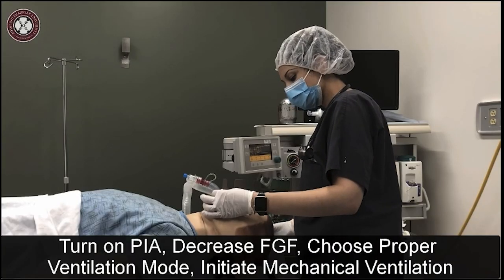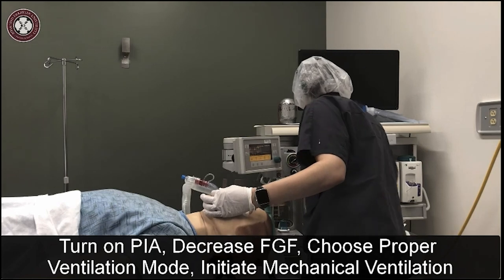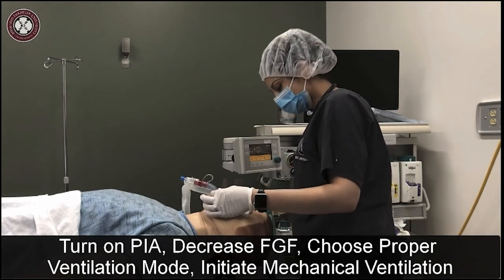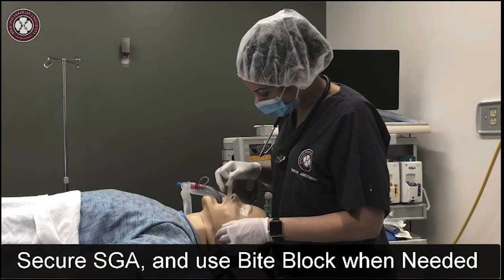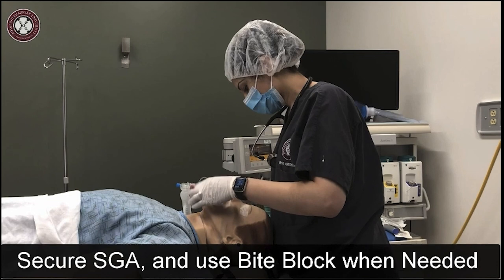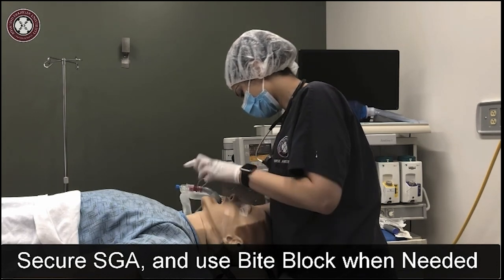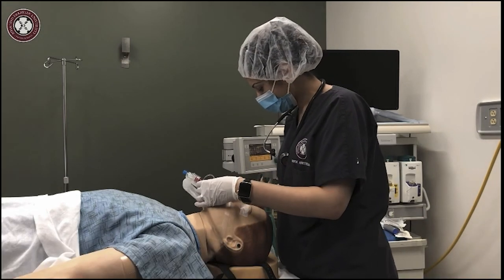With successful SGA placement, turn on the chosen potent inhalation agent to the appropriate MAC level, decrease fresh gas flows, and initiate mechanical ventilation with the proper ventilation mode. Secure the supraglottic device with tape and use a bite block if needed. Be sure to document the procedure.